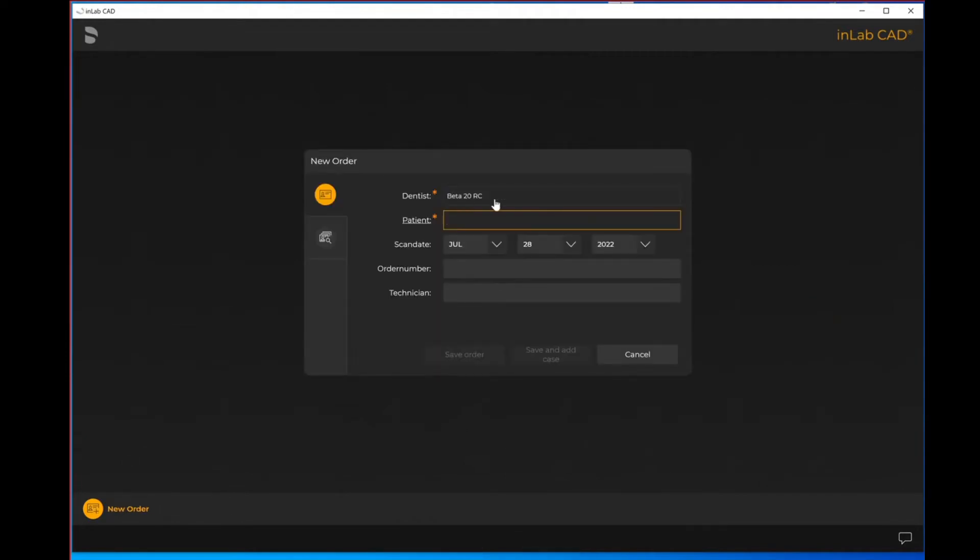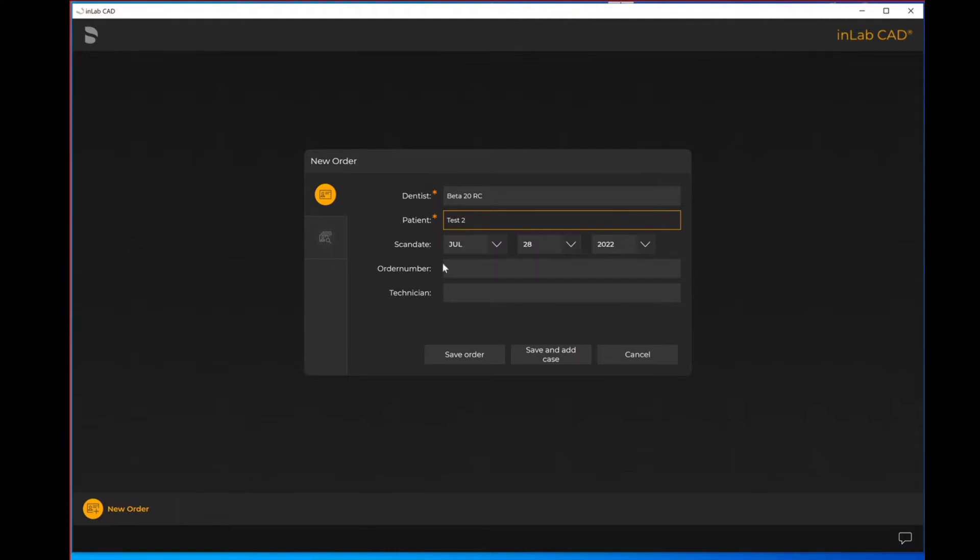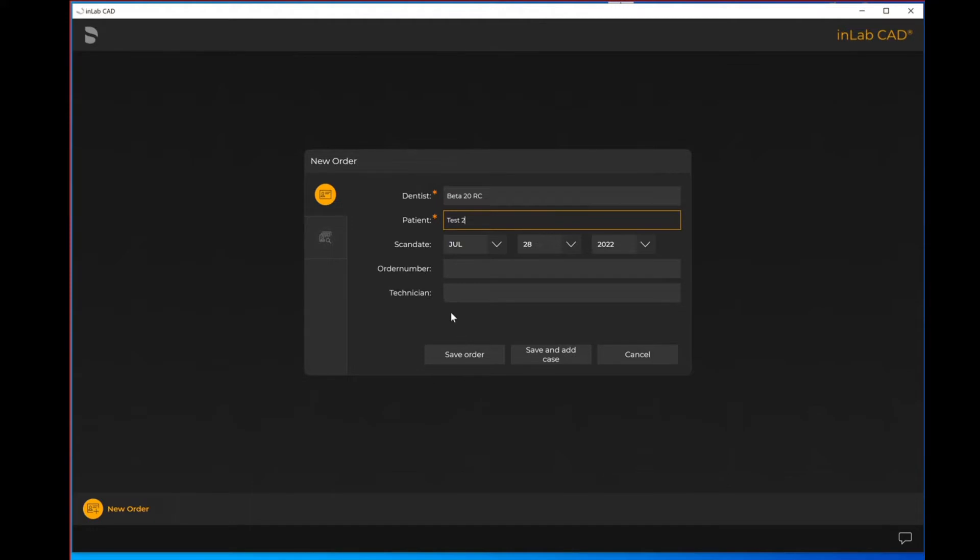Under the dentist name, I can select whatever dentist I had highlighted. I will just identify the patient's name. The scan date will default to today's date. If you did have an order number or you wanted to specify which technician was working on the case you can identify those. However, the only items with the asterisks are the ones that are mandatory to fill in.